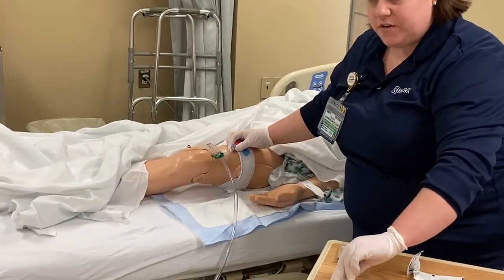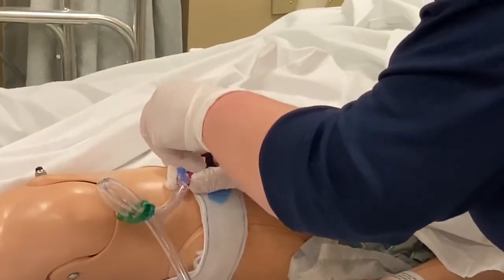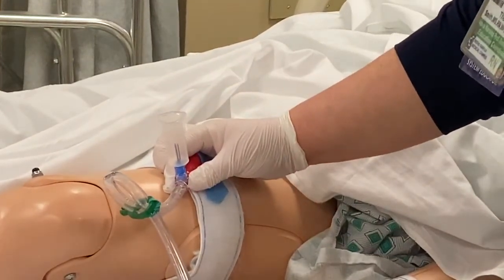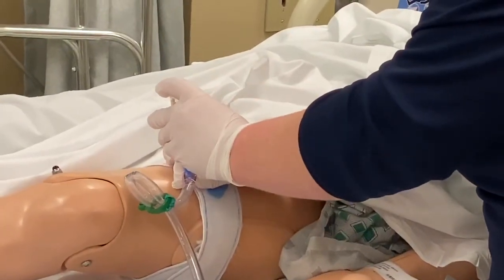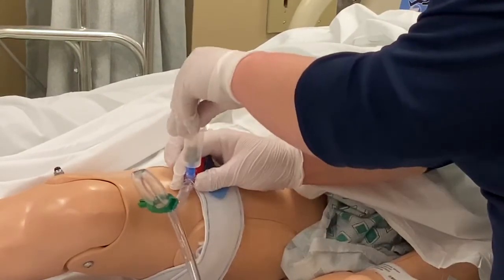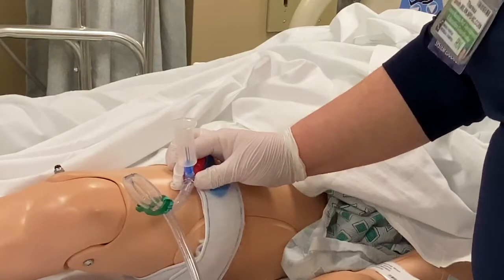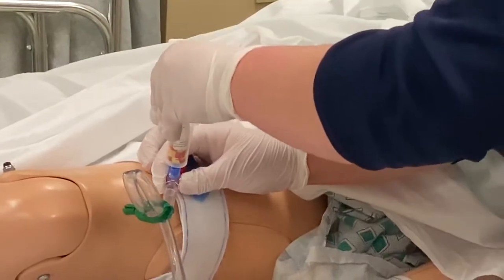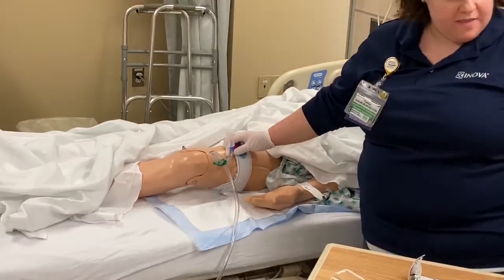So I'm going to take my transfer device and I'm going to place it on this port. So I push and twist, okay? And then I'm going to put my tubes in. So the gray tube always goes first. So I'm just going to push this in and it will fill up with urine. Once that has filled, I can take it out and set it on my bedside table. Then I will take my red and yellow tube and I will allow that to fill up. And I'm going to make sure that I allow my tubes to fill completely. Once that is finished, I will take that out.